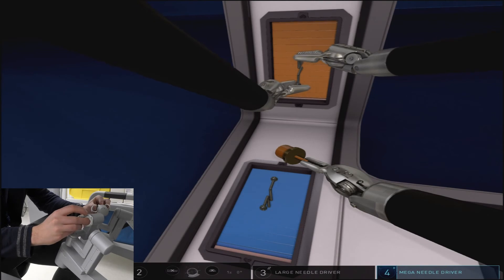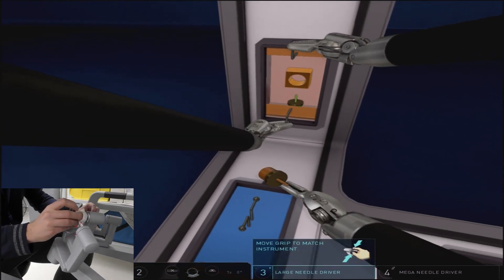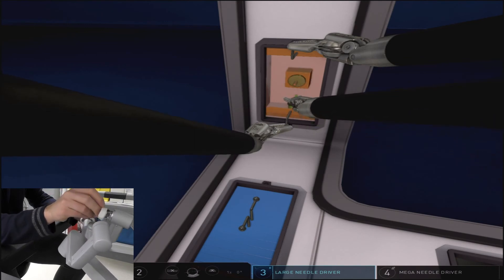Make sure to keep all three instruments in your camera view at all times. You'll see that I get a little warning sign at the top there suggesting that my right arm is coming out of view, and therefore a quick adjustment with the camera got rid of that warning.